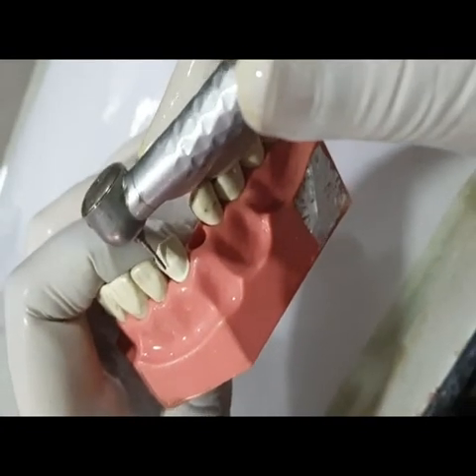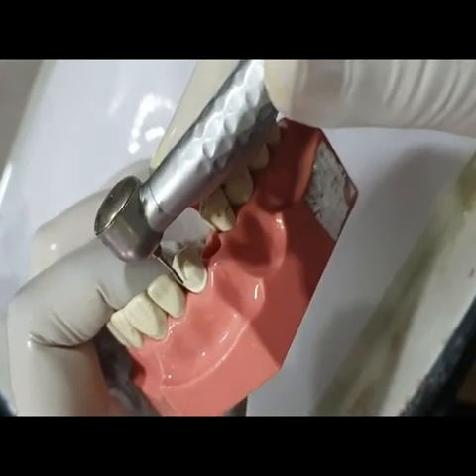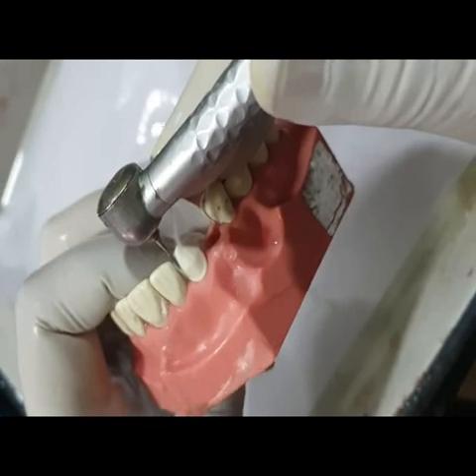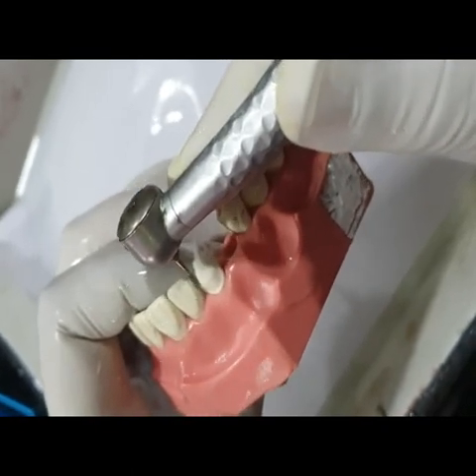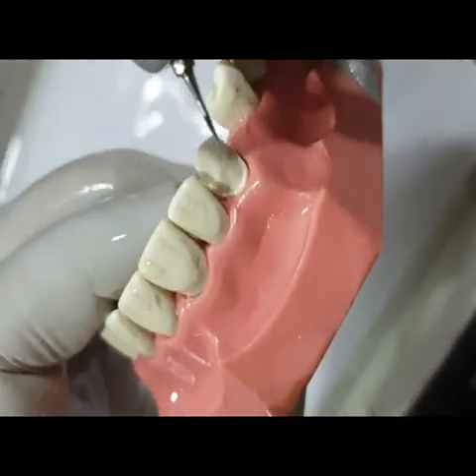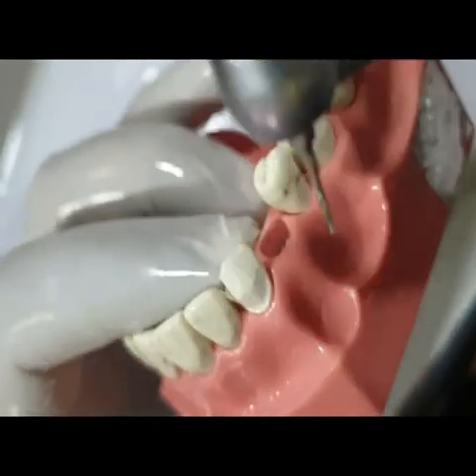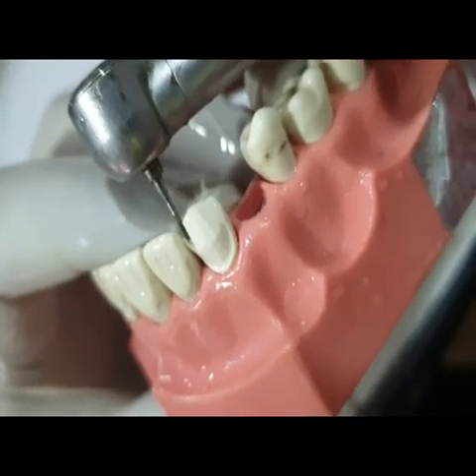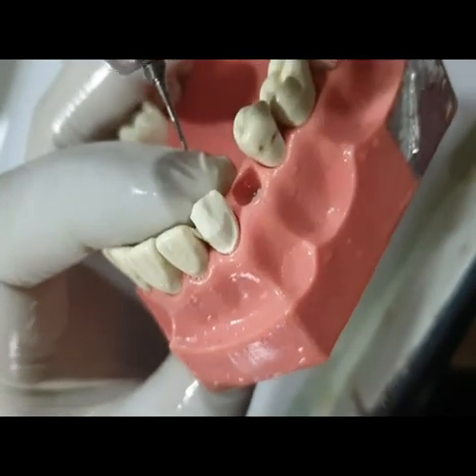Now we have to do proximal reduction. For proximal reduction, we use a very thin needle bur, keep it on the proximal area, and do reduction in such a manner that a small lip of enamel remains on the adjacent tooth. Can you appreciate this small lip of enamel? This lip of enamel is ensuring that we have not encroached upon the adjacent tooth and have not prepared any area of the adjacent tooth.